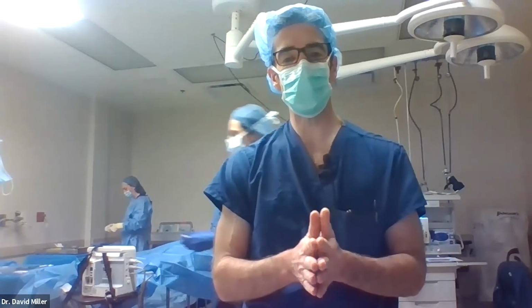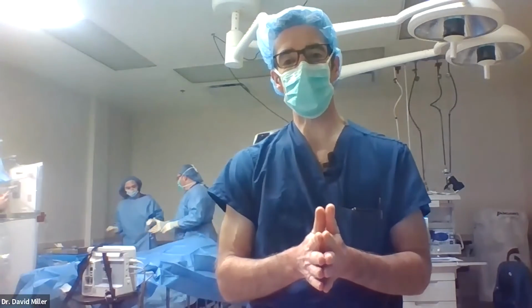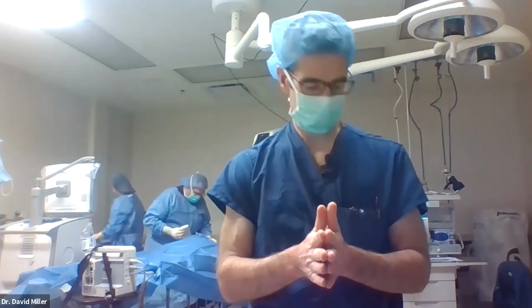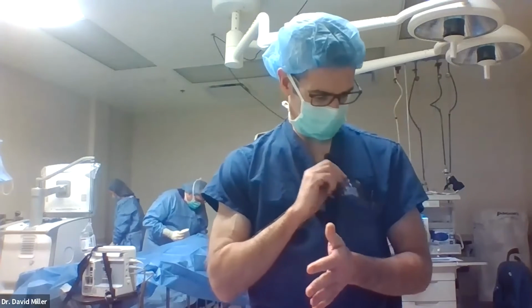But if you can keep that retinotomy small, keep it nasal, which projects way out to the temporal field, not anywhere near the macula. I think I've almost never had a patient complain of visual field loss from their retinotomy site.